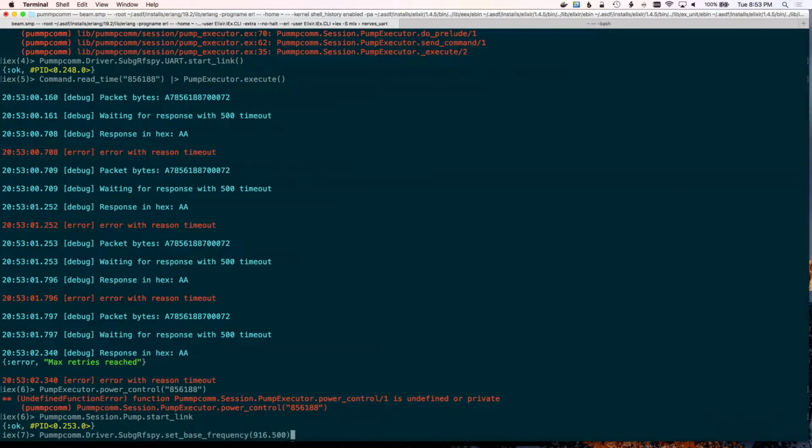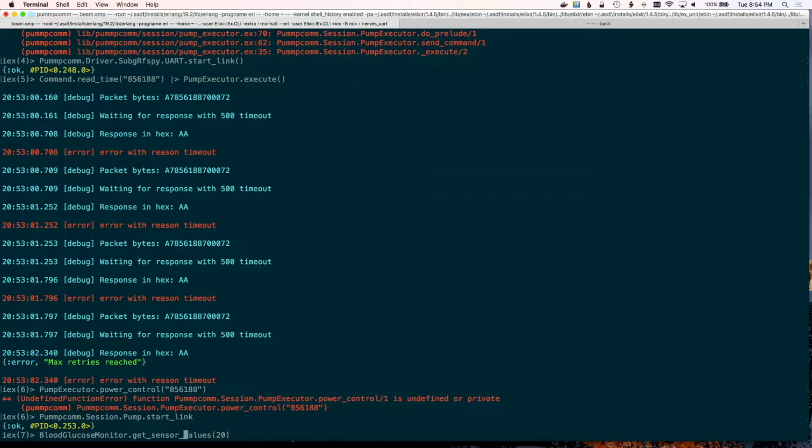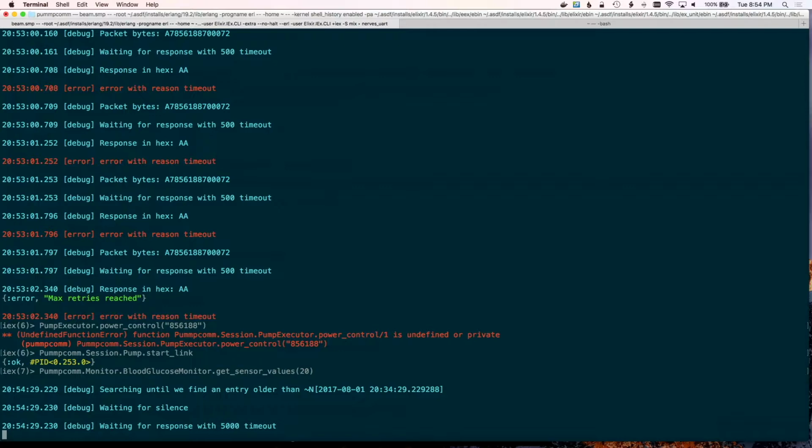I'm just going to try executing a different command here on the pump level to get it woken up, because it's been a little while since I've gone that low level on it. Sure. So this is at quite a bit higher level. This is the monitor for the blood glucose information. So this is the CGM loop, and it's able to take information from the pump gen server's response and parse it out and get meaningful data. So really what I'm asking it here right now is, can you give me the last 20 minutes of sensor values? So let's see what happens when we do this.